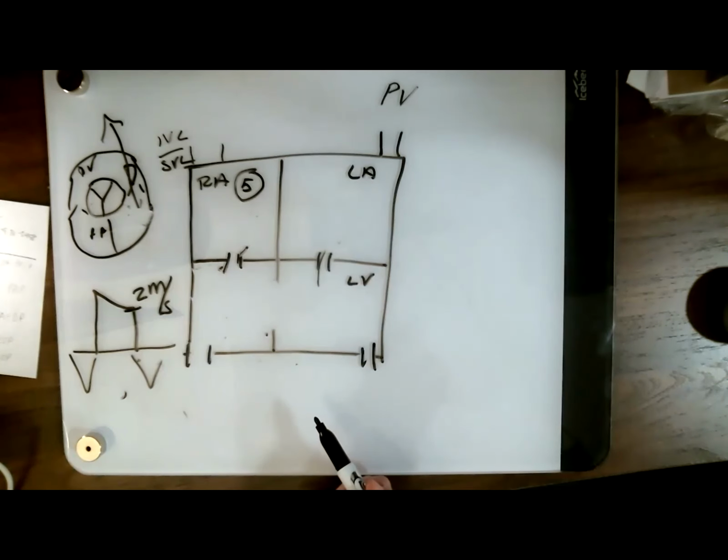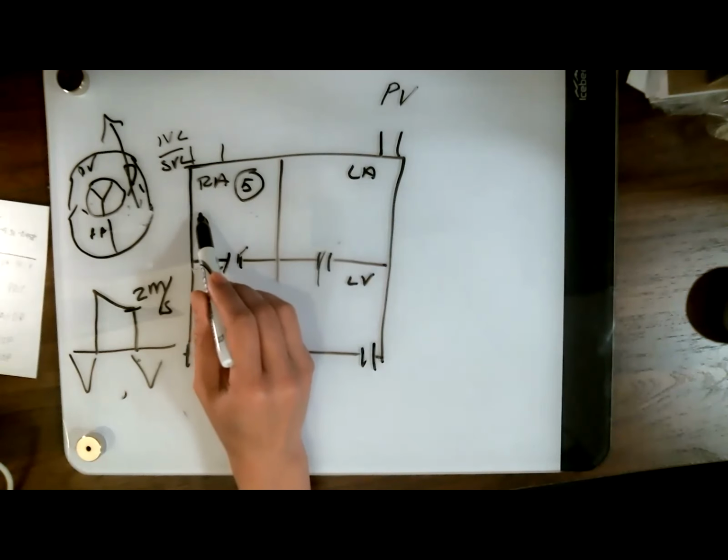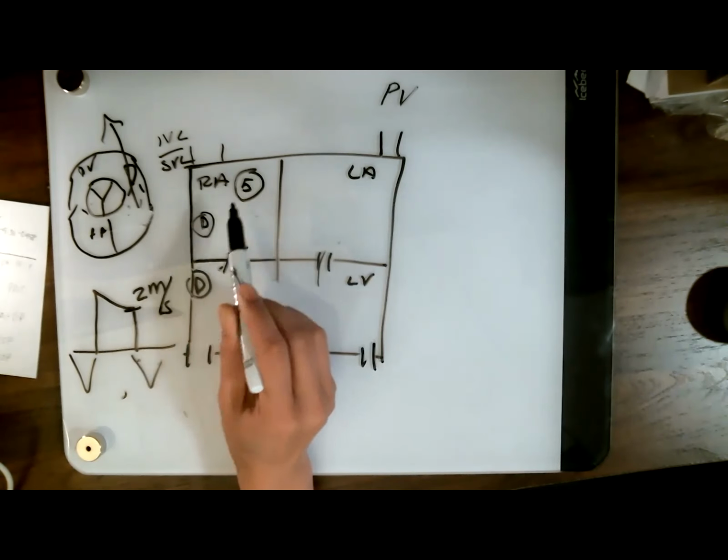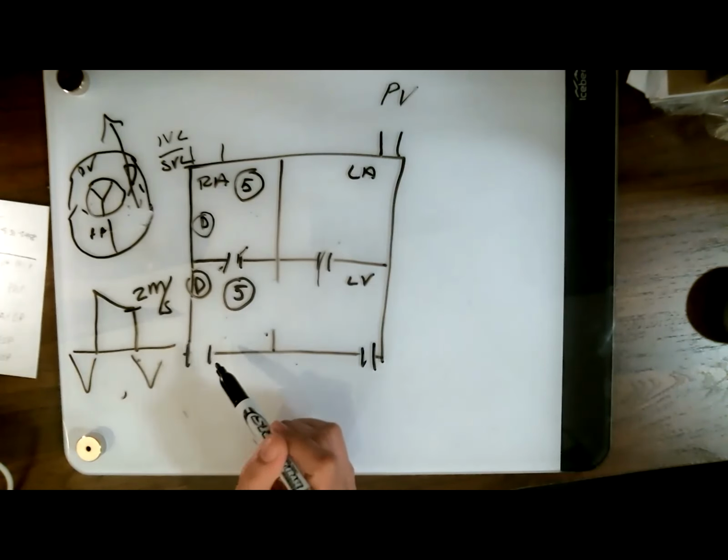Someone else want to answer, Umair? Tricuspid. Your tricuspid valve, right? So here we are in diastole. Tricuspid is open. So RA should be the same theoretically as RV diastolic pressure. So we got 5 here.